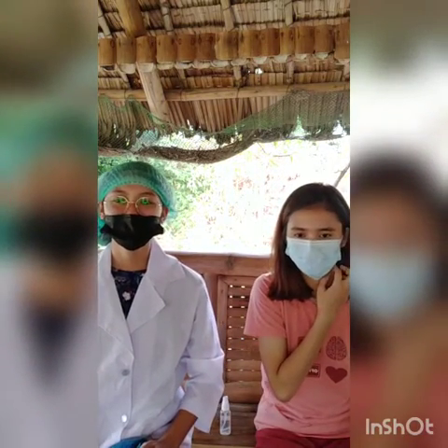And then after that, for the evaluation, the blood pressure is measured accurately and without any injury of the client. And then for the documentation, record the findings on the paper or a computerized record. So, ma'am, yung blood pressure nyo po is normal lang po siya, ma'am. So, 120/80 po siya.